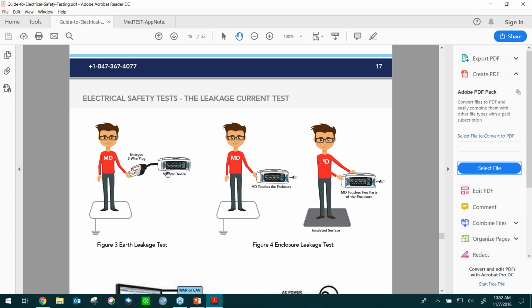If somehow a medical device is ungrounded, a measuring device, MD, comes in contact, how much leakage are you going to see flow from the mains input back through this person back to ground? That's entirely possible. We've seen numbers like 2 milliamps, 0.5 milliamps. So 2.5 milliamps could happen through an MD if the ground is opened up. That's enough to feel the shock.